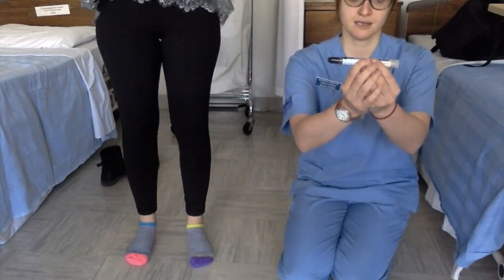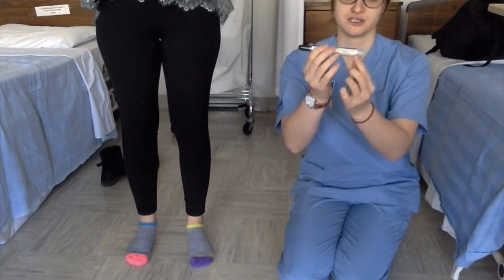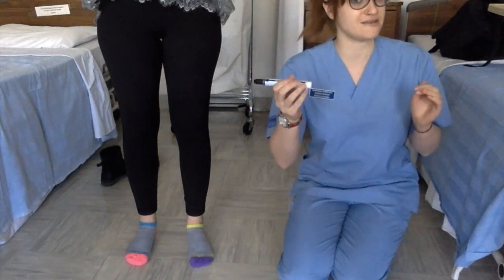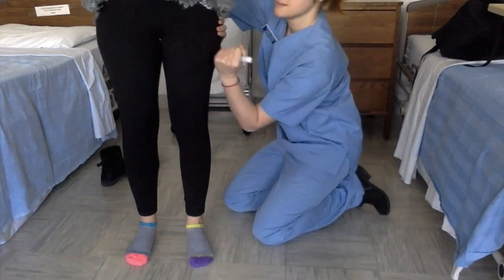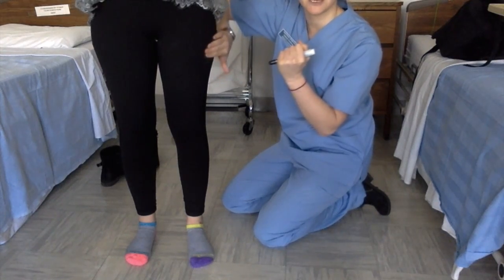This here is the tester — this is where the needle would come out, and this is your safety cap. You pull the safety cap. Don't worry about pants because it's designed to go through any sort of material, even jeans. You take the outermost part of the thigh, push in, hear the clicking noise, pull out, and massage the area for 10 seconds.